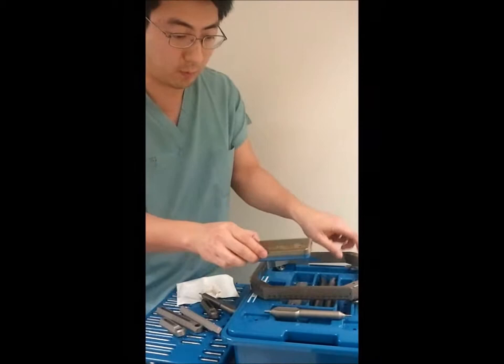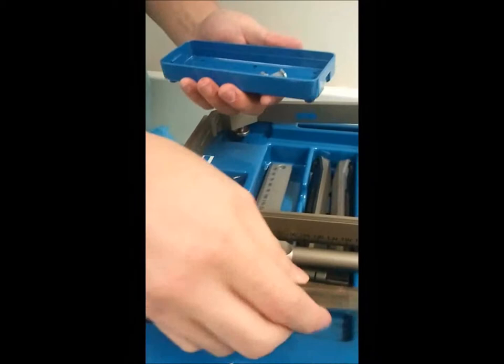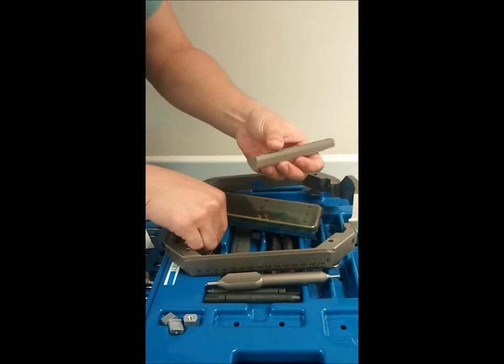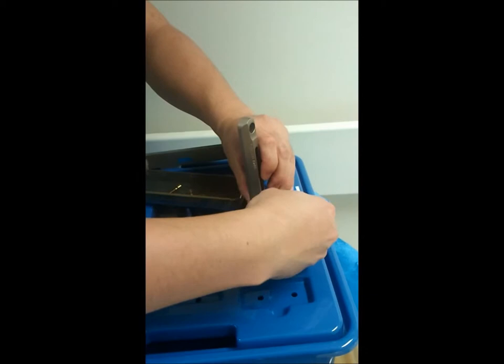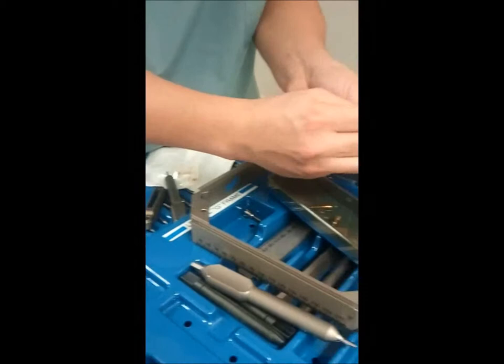Tighten that down there. Now we're ready to deal with our posts. We want to get four of the screw and nut pieces out and then set this aside. We'll use the medium sized posts on the front and hand tighten this to get it started, making sure we don't strip the screws and nuts.